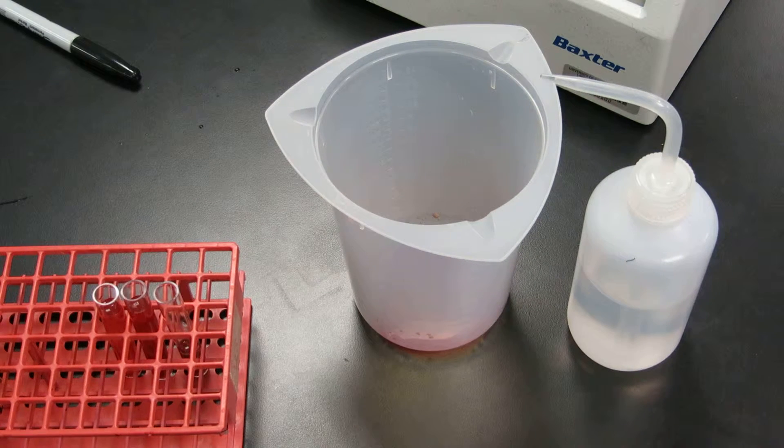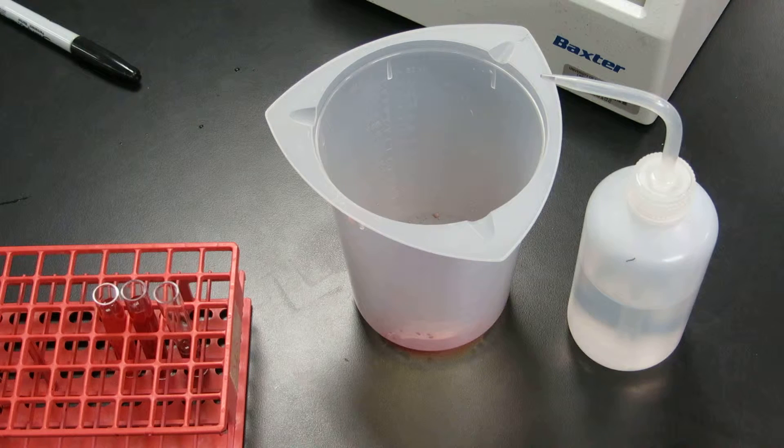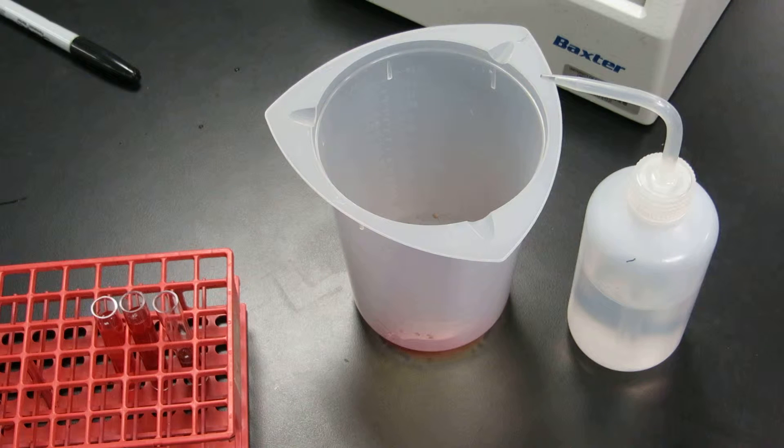This video instructs you on how to wash reactant tubes as well as 12 by 75 cell suspensions. Hopefully by the end of this video you will have a visual on exactly what it means to wash a tube four times, as well as obtain a dry button or wash cell suspensions, which often happens in student blood bank lab because we work with some older cells. However, if you ever run into trouble there are some patients where their cells need to be washed.